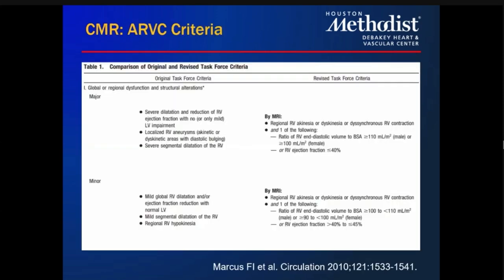Okay, but in terms of the diagnostic criteria for ARVC, remember it's a clinical diagnosis. It's not simply an imaging diagnosis. CMR just happens to be one component of it. And shown here is the 2010 task force criteria for classifying a major or minor criteria by CMR.